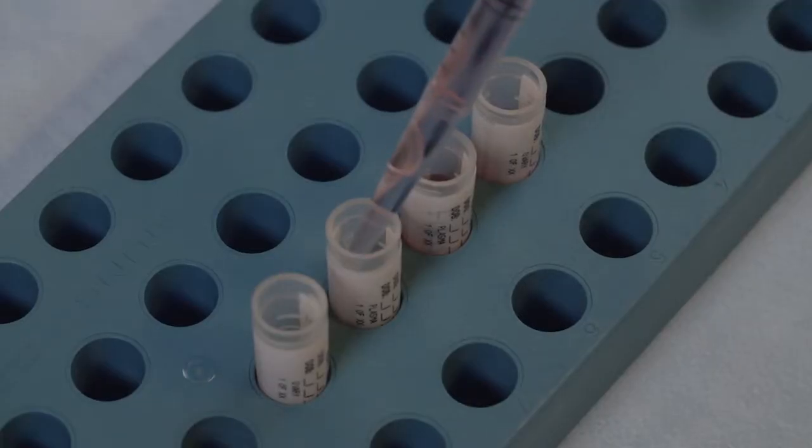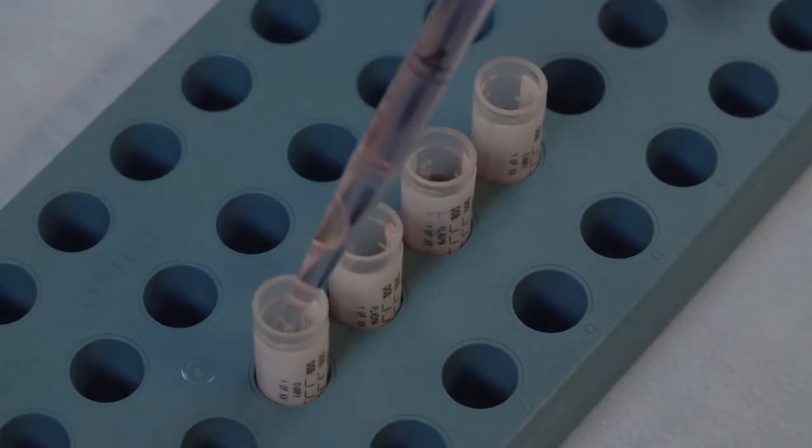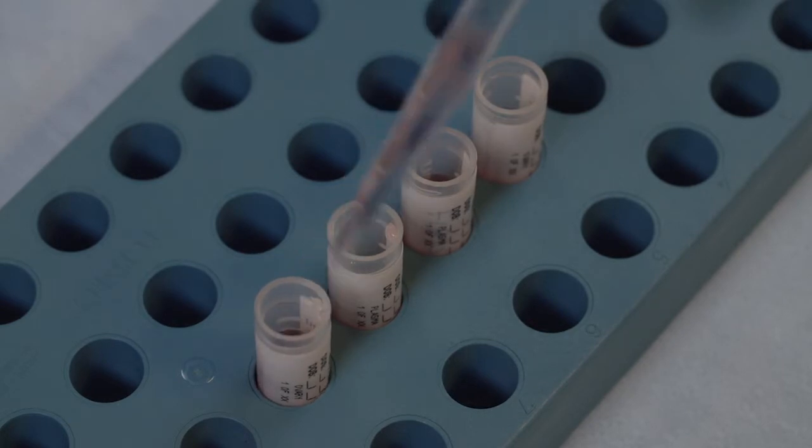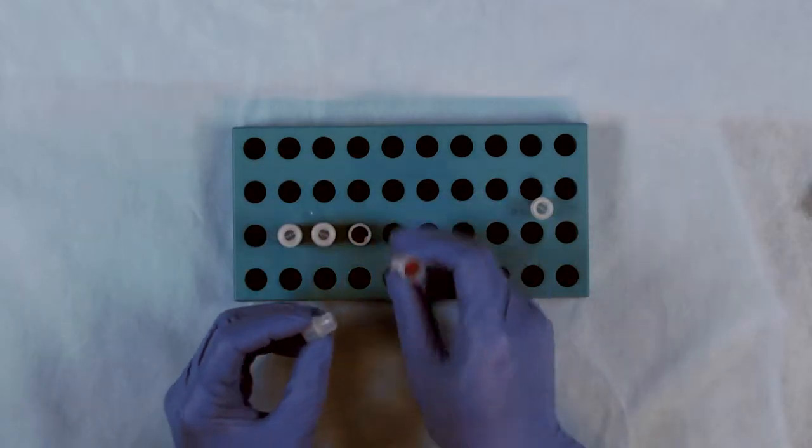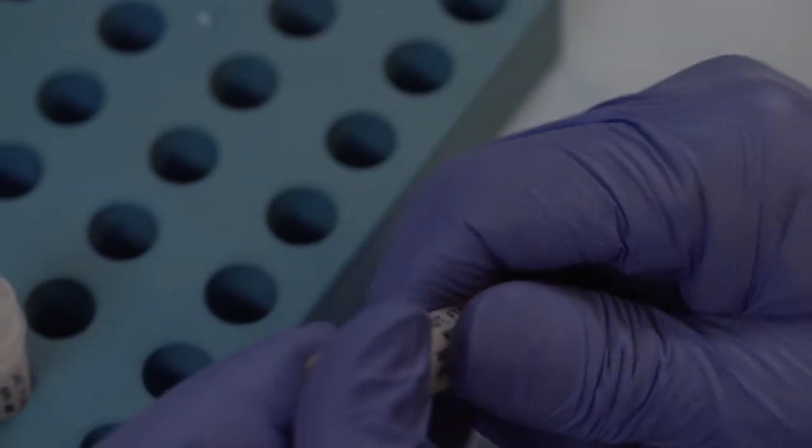Then add more cryomedia so that the final volume is up to 1.5 milliliters. Leave the vials in 4 degrees for half an hour and load the vials into the freezing machine.